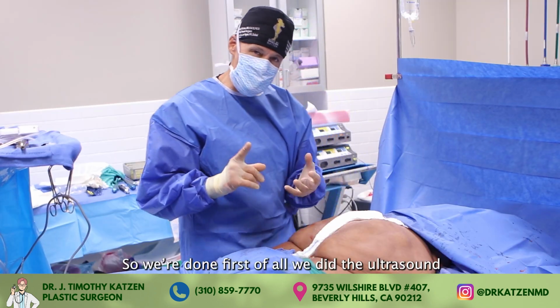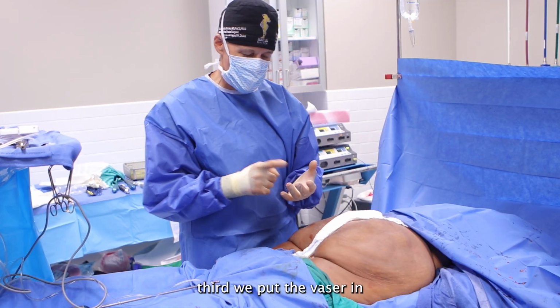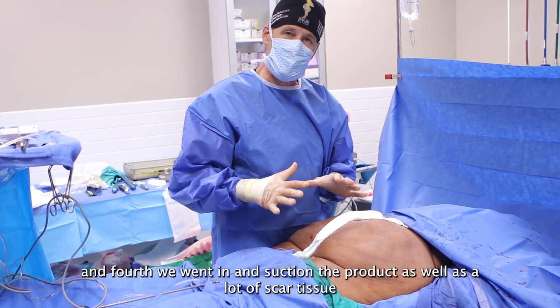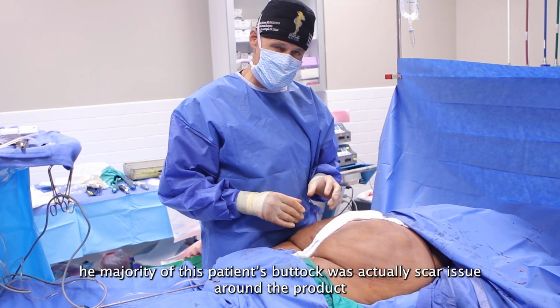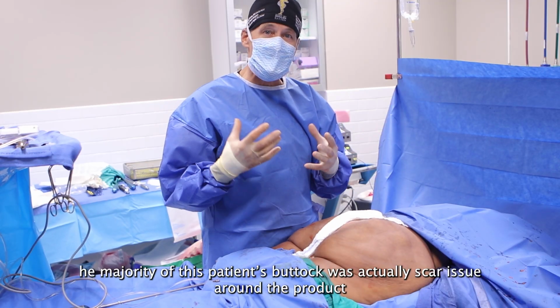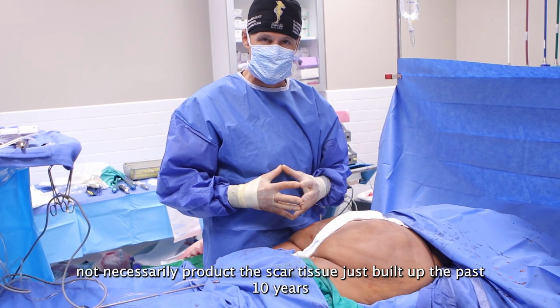So we're done. First of all, we did the ultrasound. Second of all, we put the tumescent solution in. Third, we put the Vaser in. And then fourth, we went in there and suctioned the product out, as well as a lot of scar tissue. The majority of this patient's buttock was actually scar tissue around the product, not necessarily product. The scar tissue just built up over the past 10 years.